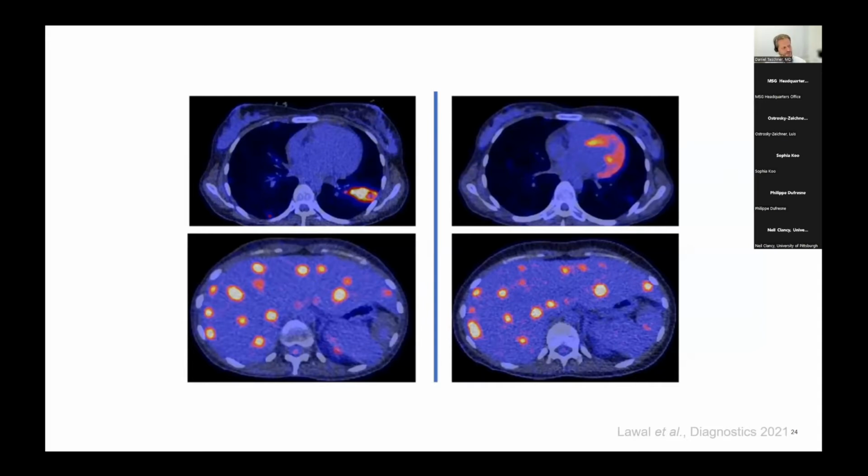He was in treatment with echinocandins. He responded well in the lungs and from a clinical point of view, but in the PET CT scan follow-up, you see there were still lesions left. So the colleagues continued treatment and didn't stop only because of biomarkers or clinical or conventional lab response.